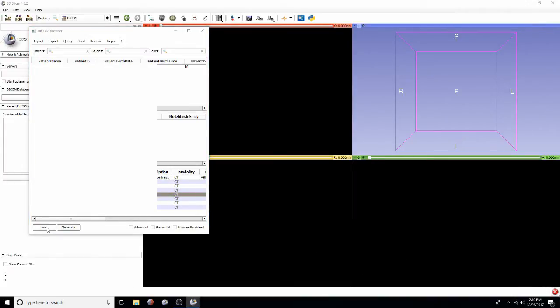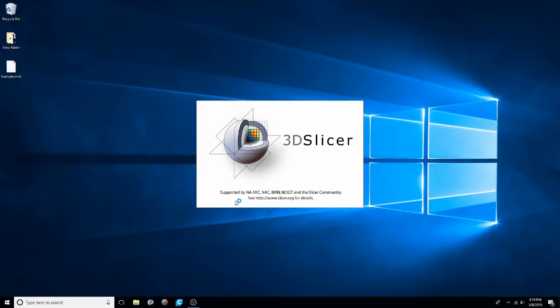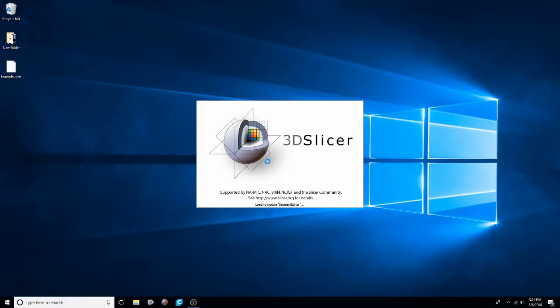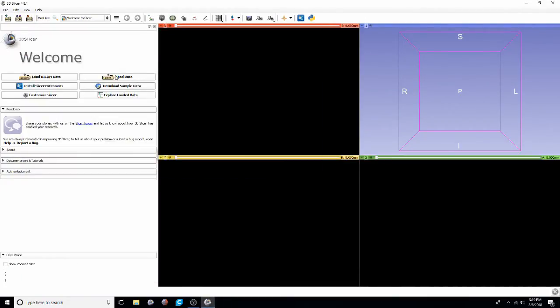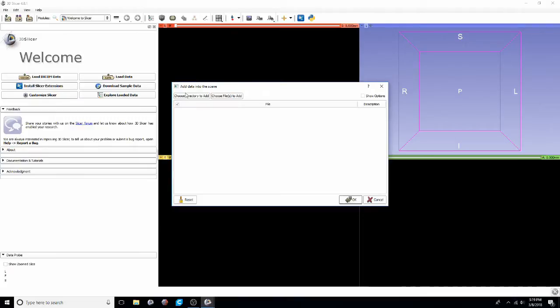For the rest of the video I'm going to use the NRRD file which is de-identified so there won't be any patient information on any of the modules. We'll be segmenting out the right hip and right femur. So instead of going to load DICOM data I'll go to load data and then select that NRRD file.